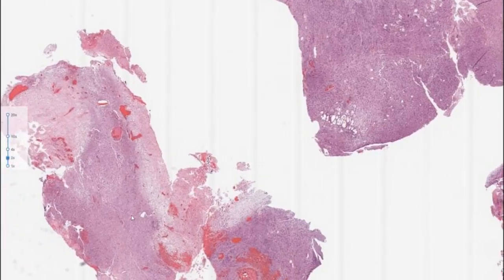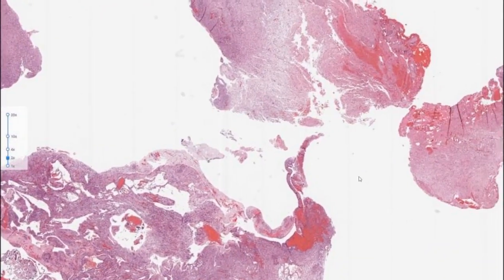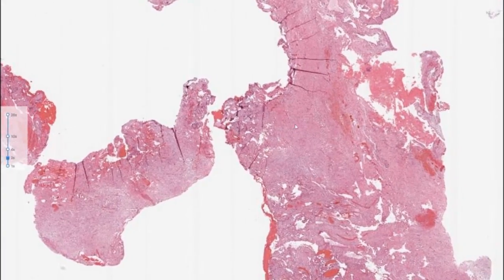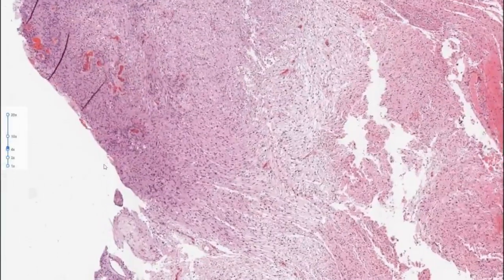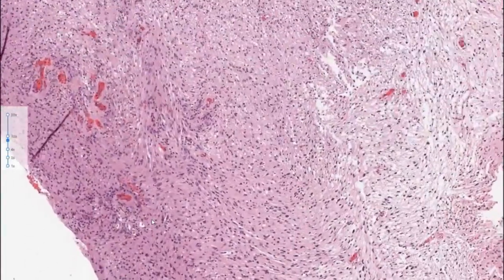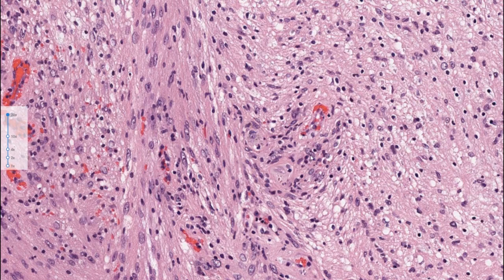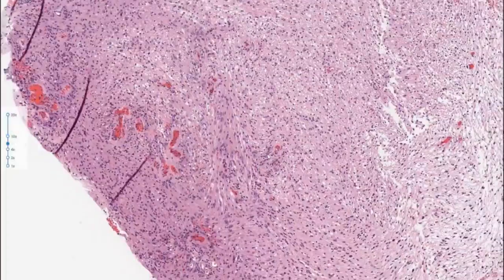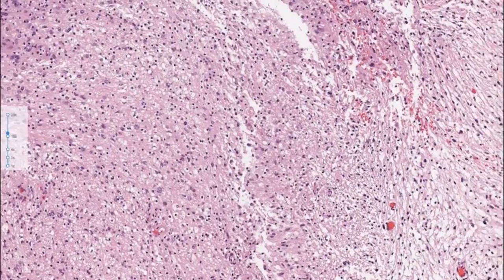This one came fragmented, and it's not uncommon to have this situation with samples that are intracranial, with some cautery. You can see that probably there was a little bit vascular. You go on high power and see a few bundles of cells. Maybe you recognize them as Schwannian, and the cells are a little bit larger than what you see with a neurofibroma. A few vacuolated cells, some of them probably part of this Schwannian neoplasm, others may be true macrophages.